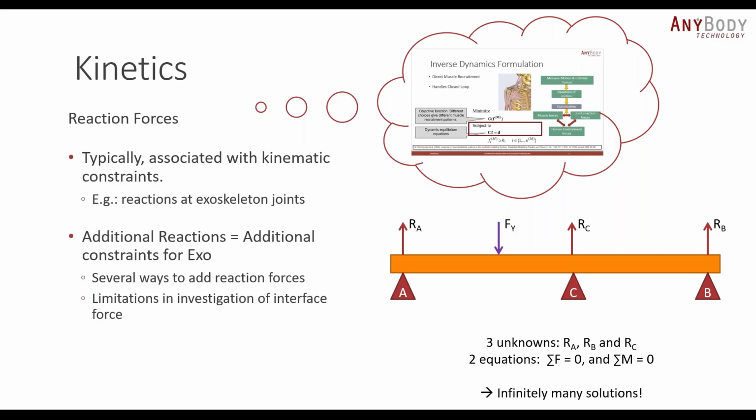And why I can talk about this separately is because in any body modeling system you can set these reaction forces and kinematic constraints, and they can be uncoupled or decoupled from each other.